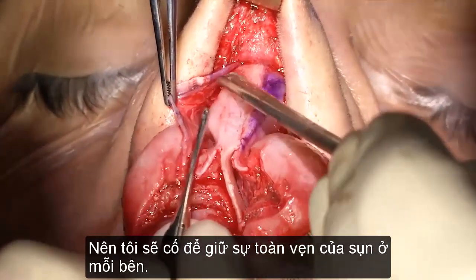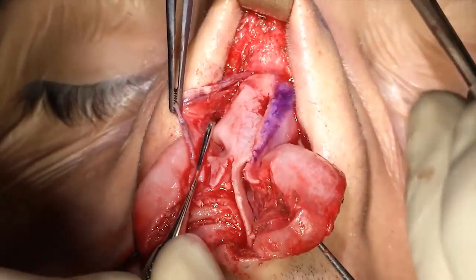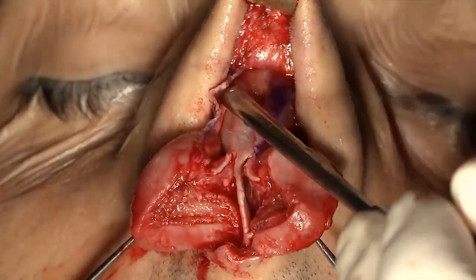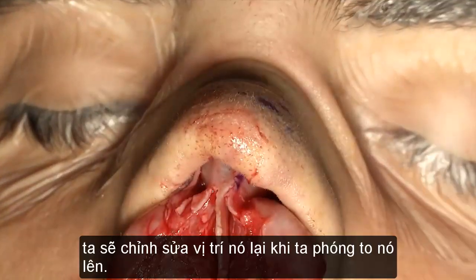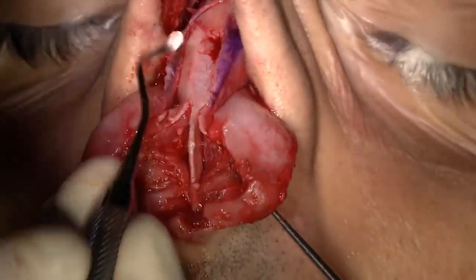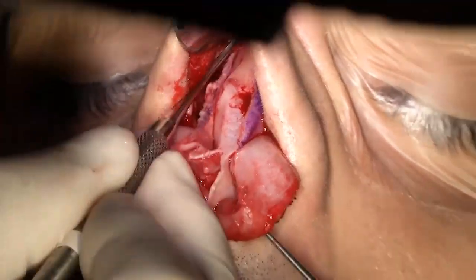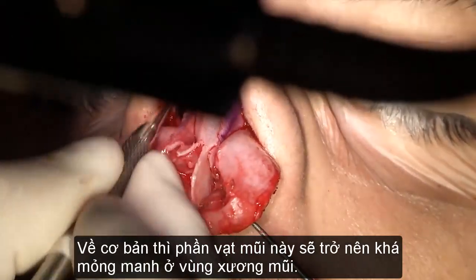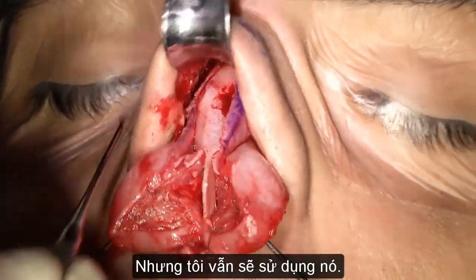So I'll try to keep its integrity on the other side. Let me restate all this so we go under magnification. Essentially, this flap becomes really flimsy at the bone, but I will still use some of it.